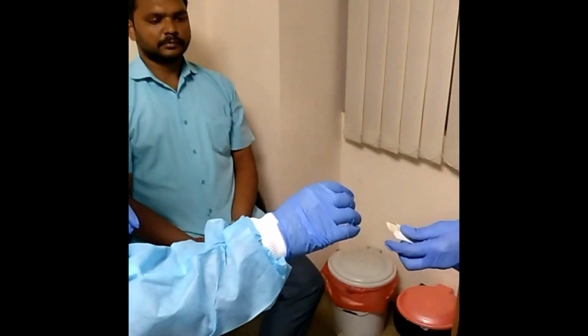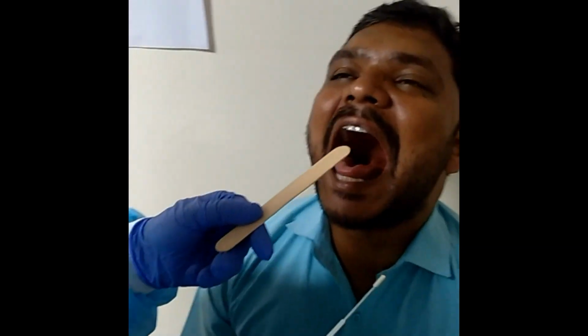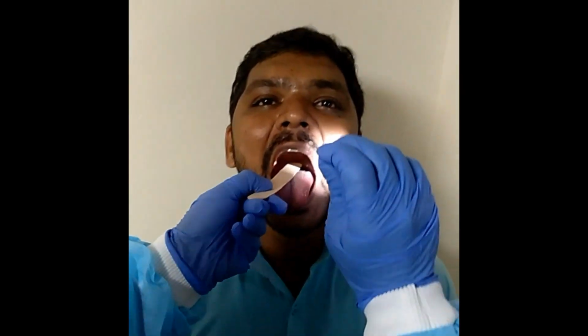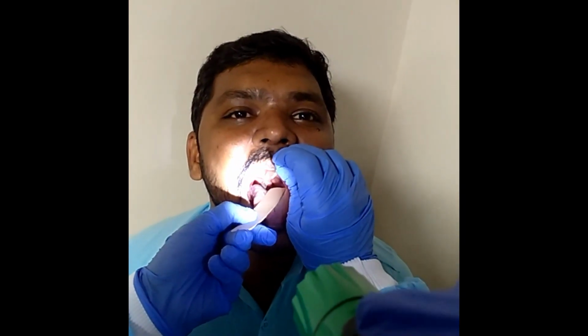Position the patient in a comfortable posture, if possible with head against a wall so that he or she does not move the head during the sample collection procedure. Remove the swab from the package and insert it into the posterior pharynx and tonsillar areas. Rub swab vigorously over both tonsils and posterior pharynx. Make sure that swab head does not touch the tongue, teeth, gums, and come in contact with saliva.